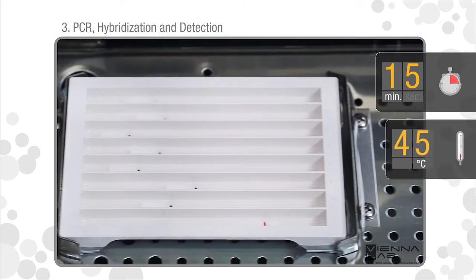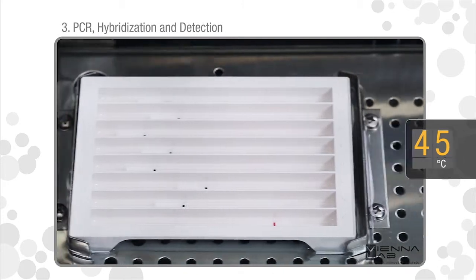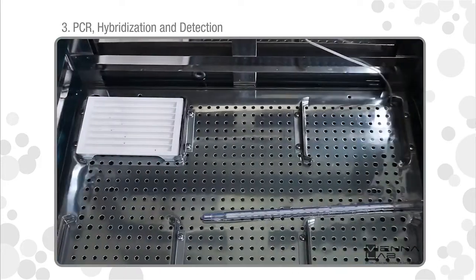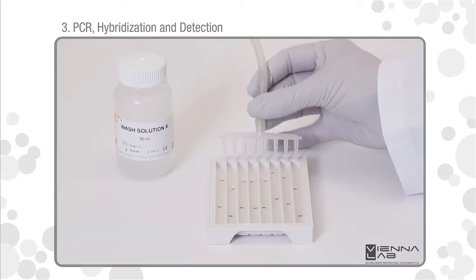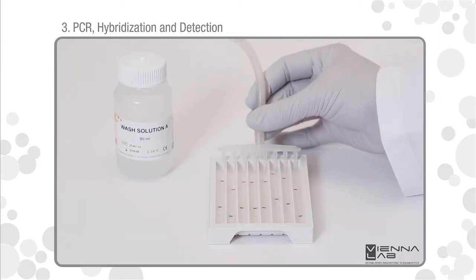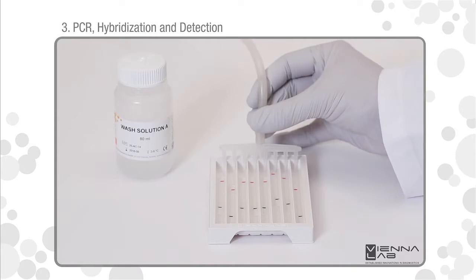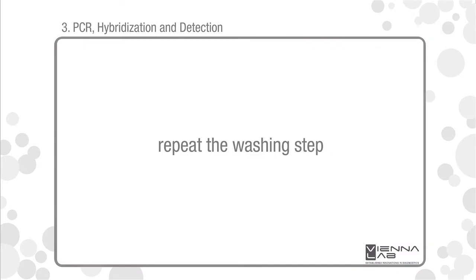Incubate for 15 minutes at 45 degrees Celsius on the shaking platform of the water bath or thermo shaker. Remove liquids by vacuum aspiration. Repeat the washing step.